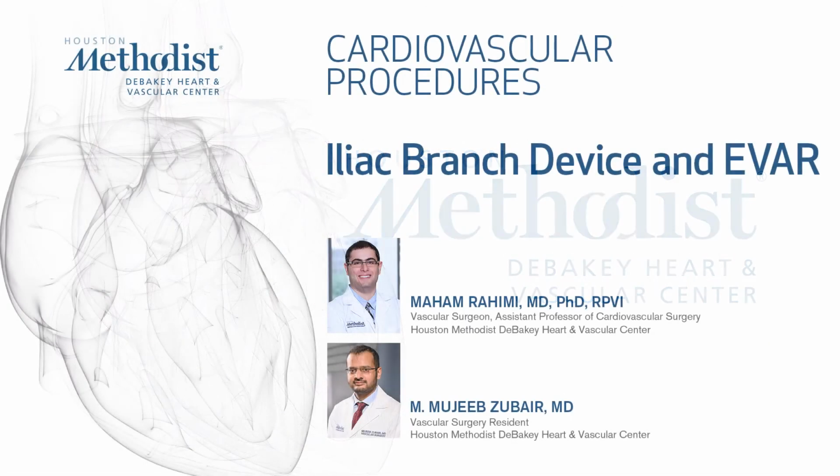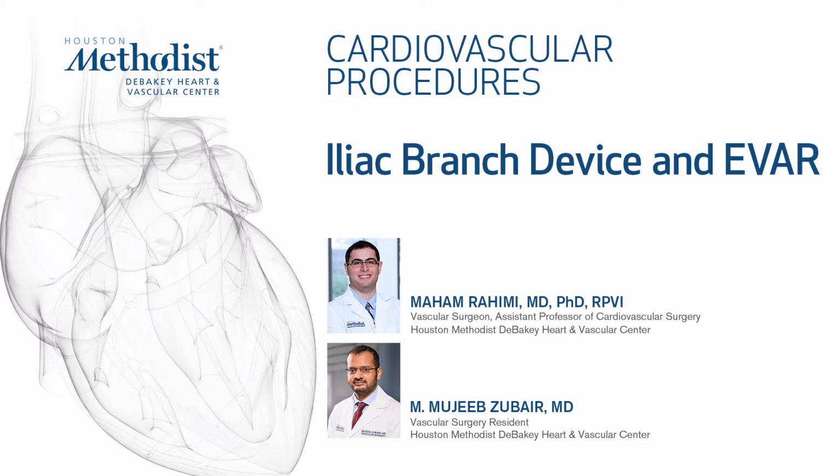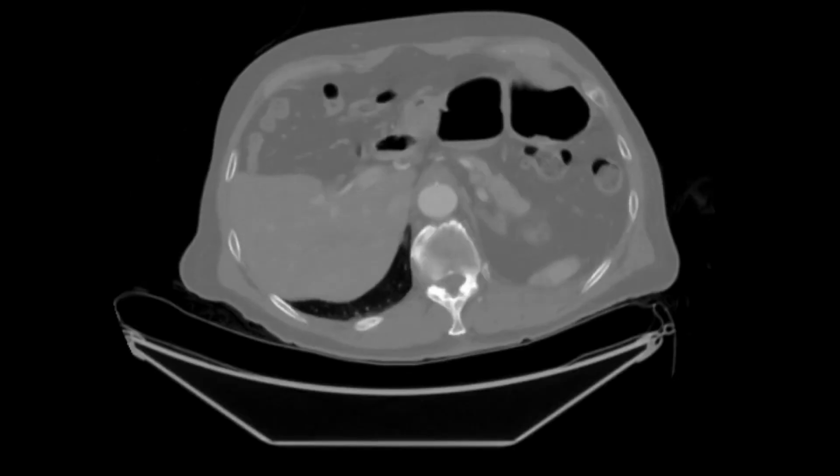This video demonstrates endovascular aneurysmal repair of an infrarenal abdominal aortic aneurysm along with bilateral common iliac artery aneurysm. Coil embolization is performed of the right internal iliac artery and an iliac branch device is used for left common iliac artery aneurysm. Our patient is a 77-year-old gentleman.